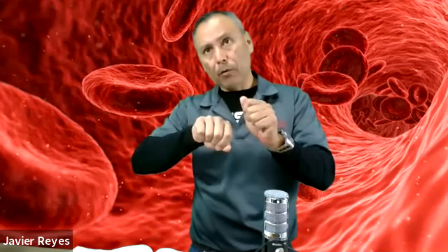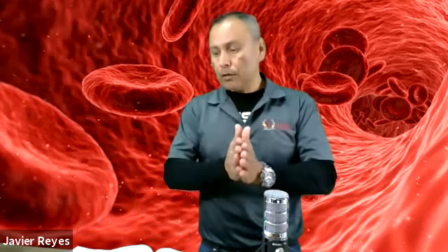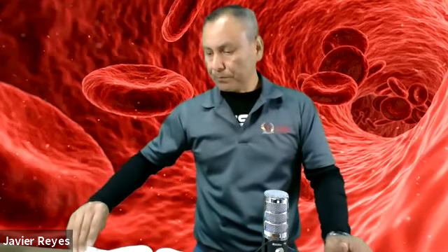And when you fill the circle, you turn the paper over and make sure that it went through the other side. Now once you collect the specimen, you're going to have to lay it on a flat surface so that it dries out. You do not want to hang it, as the blood may smear down. You do not want to overlap these papers on each other because they will stick. Blood has a sticky quality, or will clot, so it has a tendency to stick to anything. So make sure that you don't overlap these papers when you're collecting them.